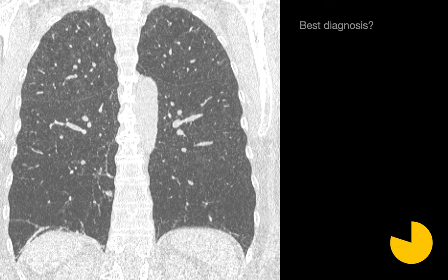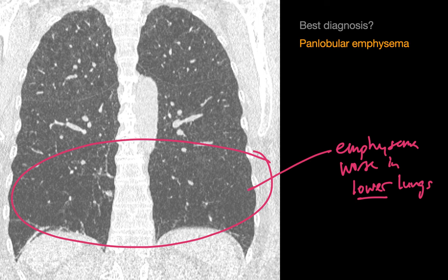What is your best diagnosis in this case? In this case, the alveolar disease is one of decreased lung attenuation rather than increased. We see regions of decreased attenuation due to emphysema most pronounced in both lower lungs, making the best diagnosis panlobular emphysema, which we may also refer to as panacinar emphysema.